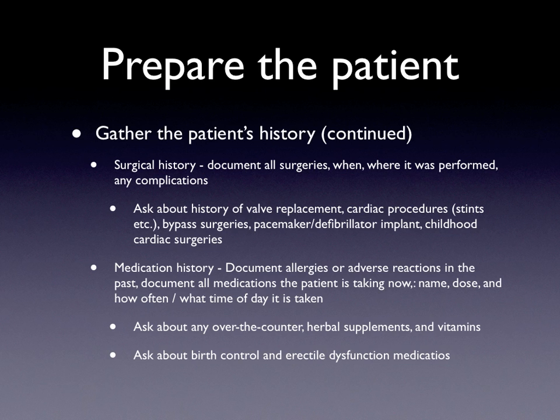Some herbal supplements can create changes on EKG. So again, that wouldn't be something you would necessarily know to look for as an EKG technician, but having that on their medical record next to the EKG can help the physician determine whether it's an herbal supplement or something else that might be causing some sort of change. Also, you need to ask about birth control and erectile dysfunction medications, unlike what it says there on the slide, medications. Not exactly sure what that's supposed to mean, but obviously I left an N off there.